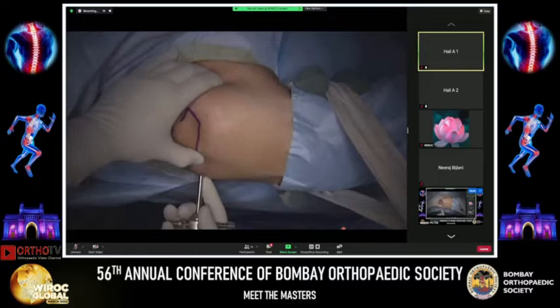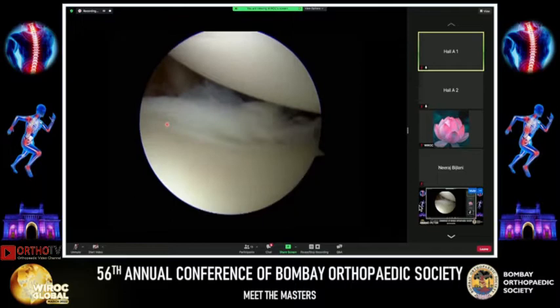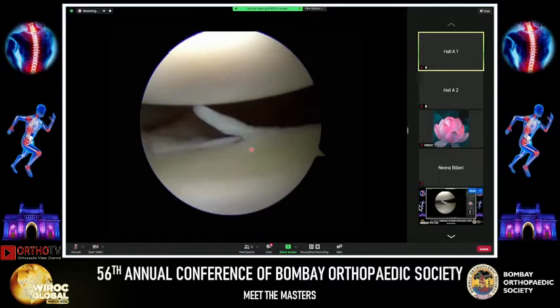The arthroscope is inserted into the shoulder and the first step is a diagnostic arthroscopy. We can see the humeral head, the glenoid, and the biceps. As soon as we enter, we can note that there seems to be a tear in the anterior inferior glenoid labrum.